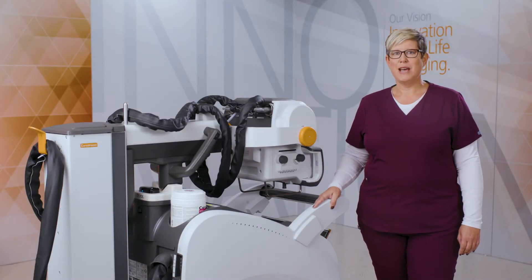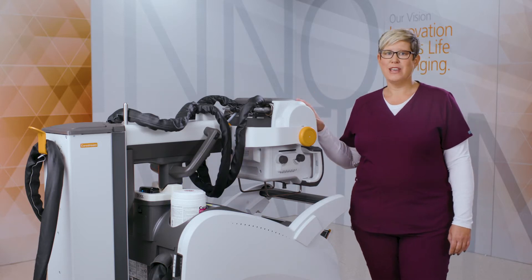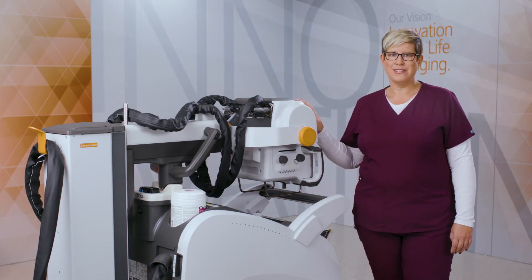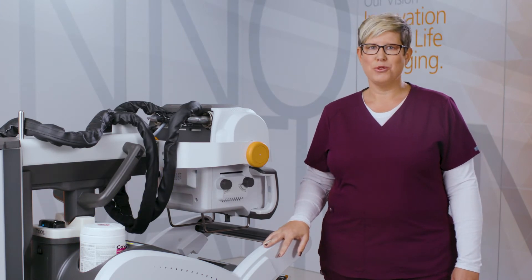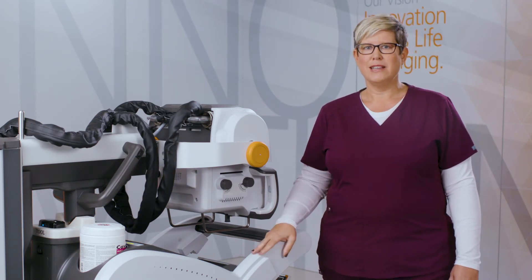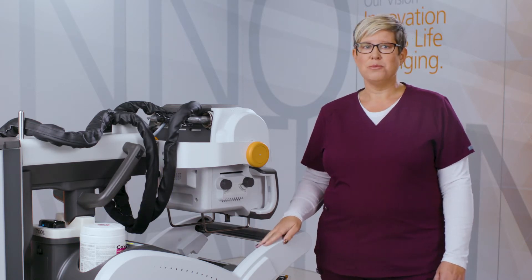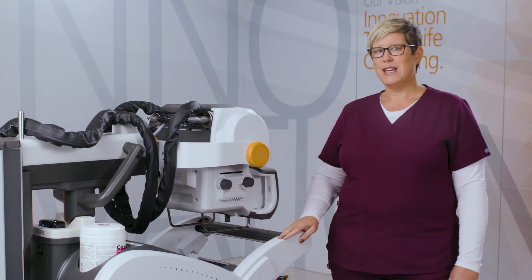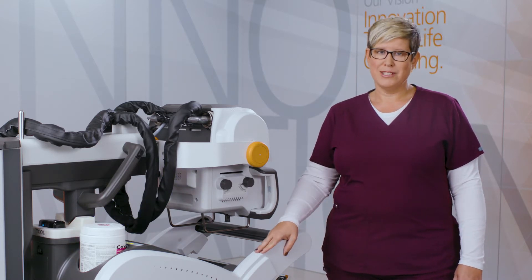Hi, I'm Jen Twaits, an applications engineer here at CareStream, and today I'm going to show you the CareStream DRX Revolution System. The CareStream DRX Revolution System is an x-ray room on wheels. It was designed to bring imaging to the patient with everything a user needs to complete an exam. The redesigned Revolution has many new features that improve workflow and productivity.